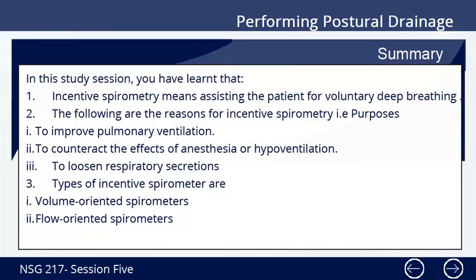Summary of study session 5. In this study session, you've learned that 1. Incentive spirometry means assisting the patient for voluntary deep breathing by providing visual feedback about inspiratory volume by using a specially designed apparatus called a spirometer.